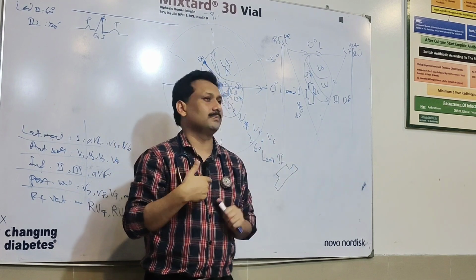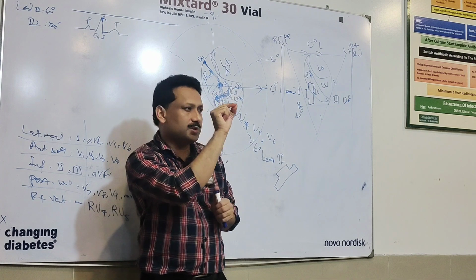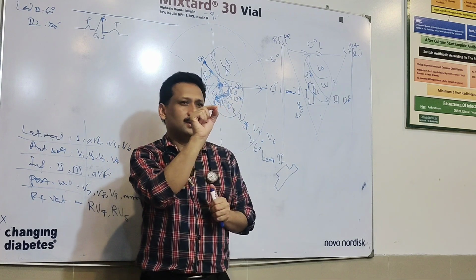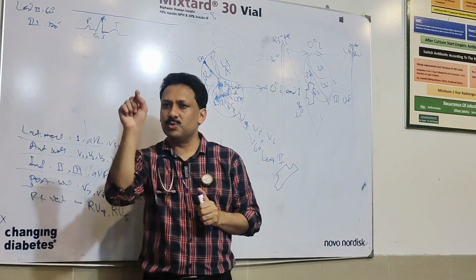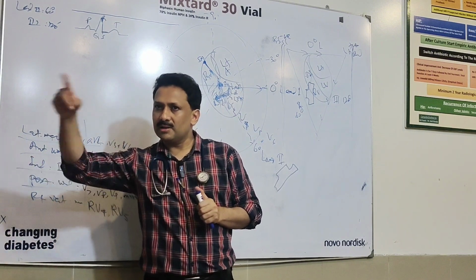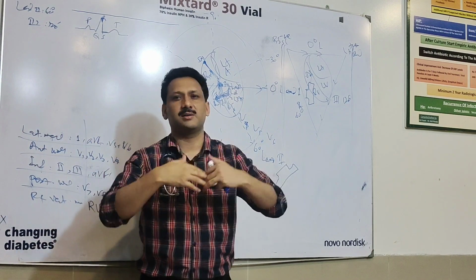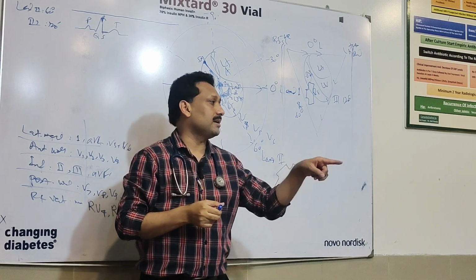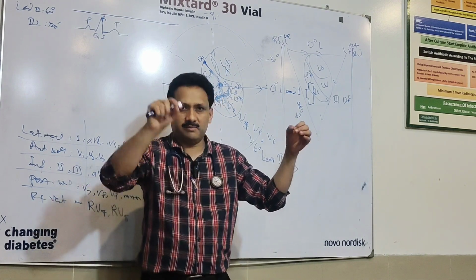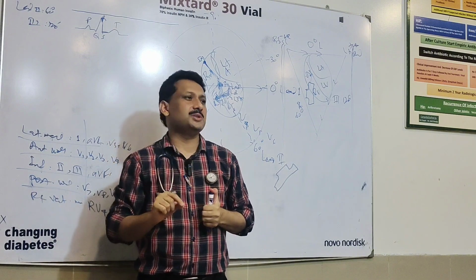This is electric current. The stylus, the fine instrument that moves on the ECG paper, needs some energy to move. This energy is carried through the electric current offered by the heart, and the work it is performing is mechanical work. So it's the mechanical work which it is doing.